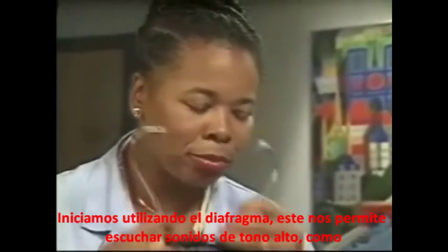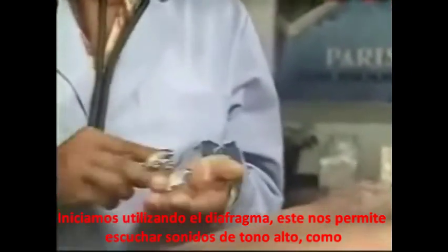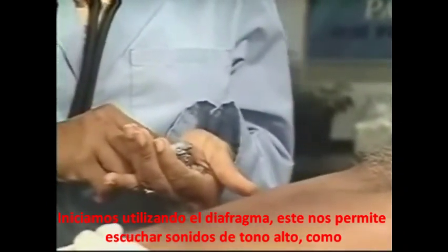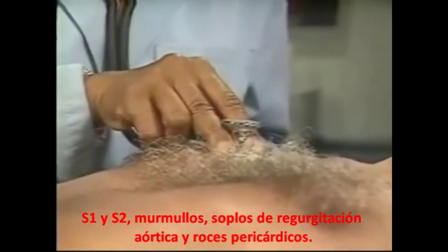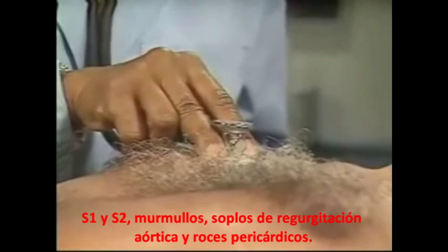What I'm going to do now is listen to your heart in the various areas of your chest. Adjust your stethoscope so that you'll be listening through the diaphragm. When pressed firmly on the chest, the diaphragm is best for hearing relatively high-pitched sounds, such as S1, S2, the murmurs of aortic and mitral regurgitation, and pericardial friction rubs.